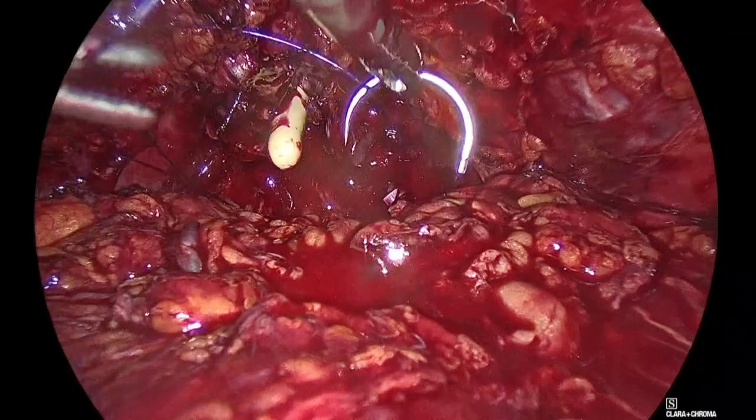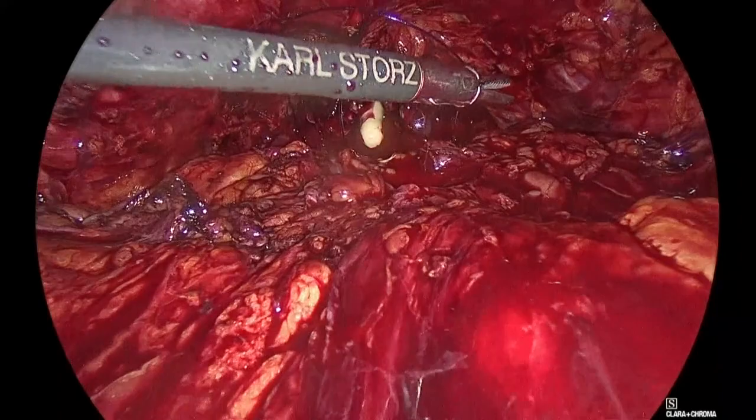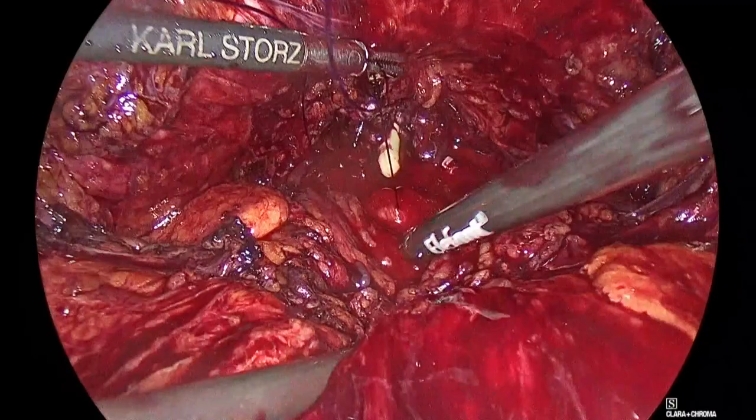Now, normally you need to be careful not to lock, but in this case, it's not a big issue, because the first suture has come in. Even if it locks, it's a gripping suture. You see that our space is limited here, because the patient is not in extreme Trendelenburg. I didn't want to have him in extreme Trendelenburg. So good. Panagiotis, aspirate there and aspirate down there also.